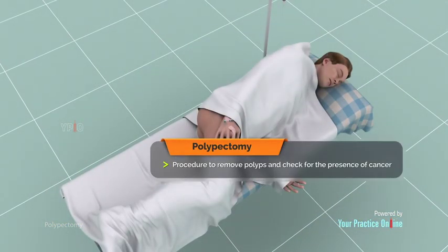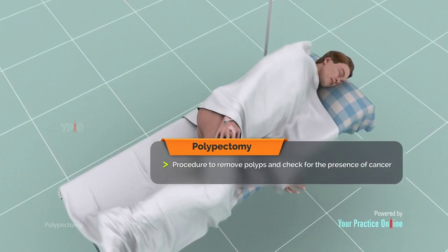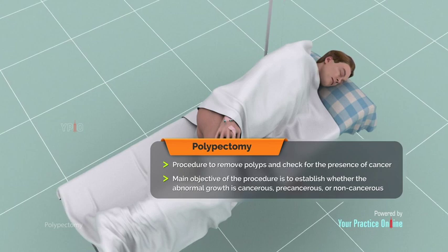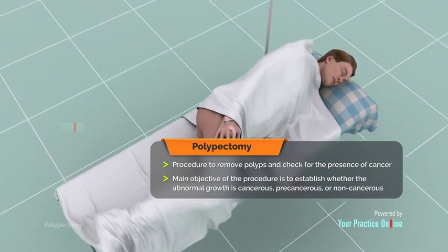Summary. A polypectomy is a routine procedure to remove polyps and check for the presence of cancer. The main objective of the procedure is to establish whether the abnormal growth is cancerous, precancerous, or non-cancerous.